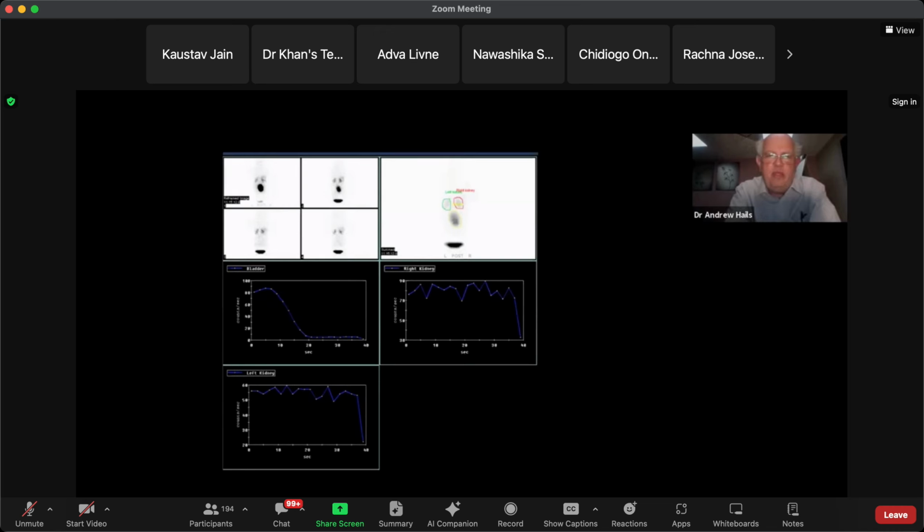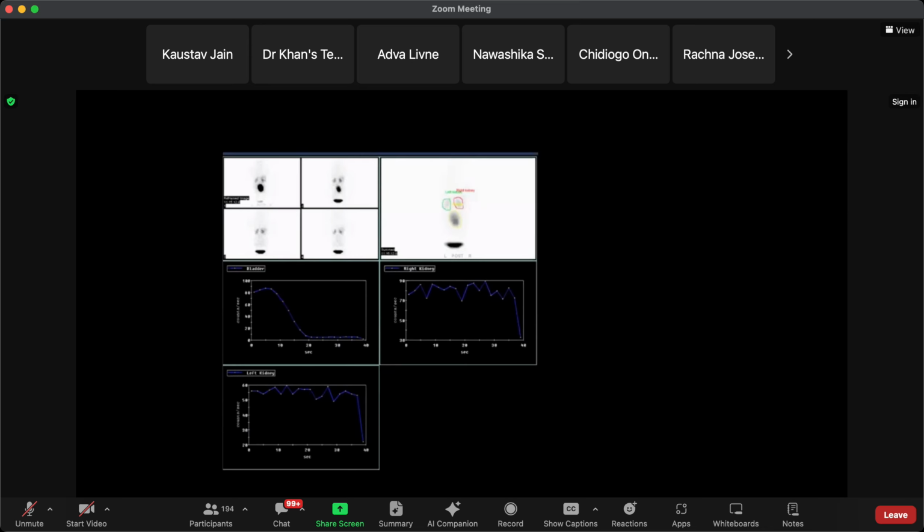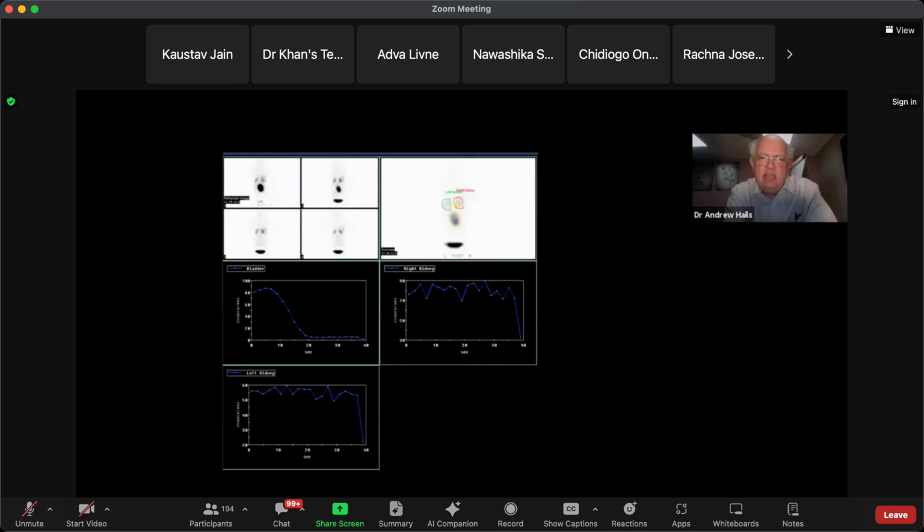Well, yes. You don't know what it's called? Probably not. A micturating study of some kind? Yes, it is. It's an indirect micturating cystogram, okay?